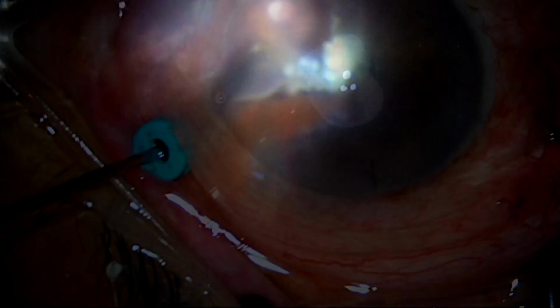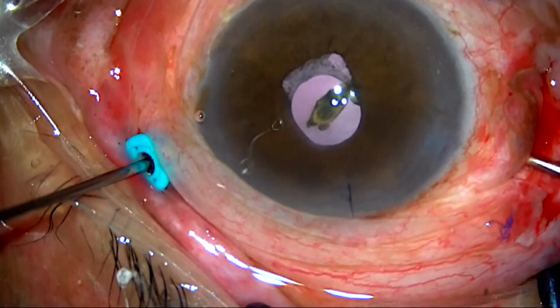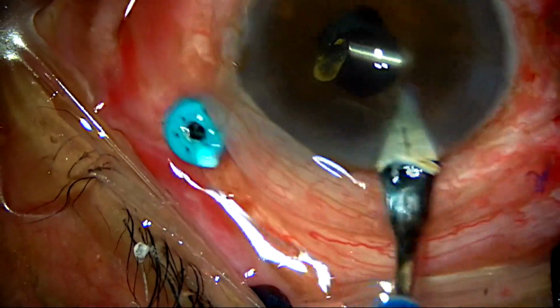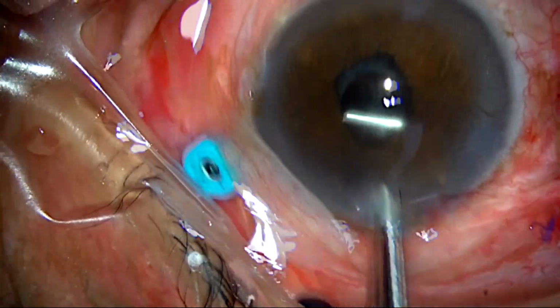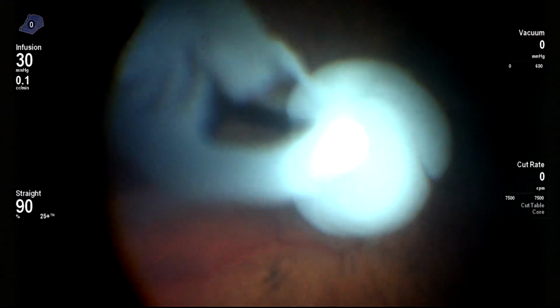The foreign body was nudged out from the subretinal space with the help of an intraocular magnet. Then the foreign body was removed from the limbus. Following which the retina was settled with PFCL and laser was done. Silicone oil injected. It started as a usual case of epiretinal membrane.